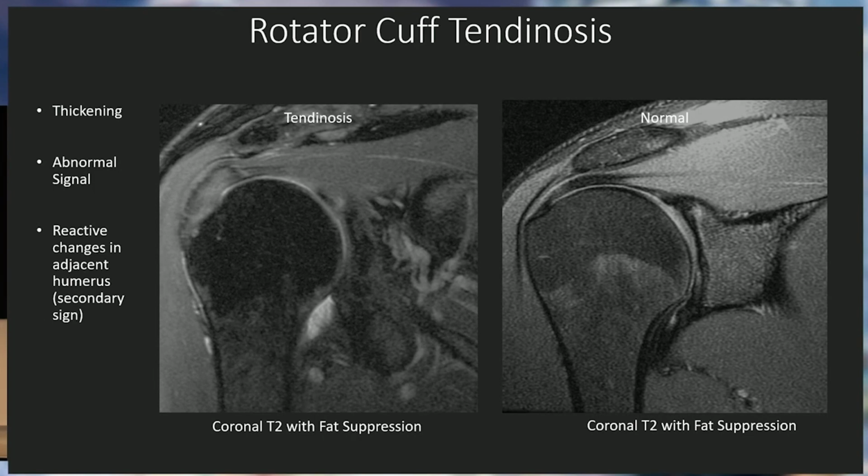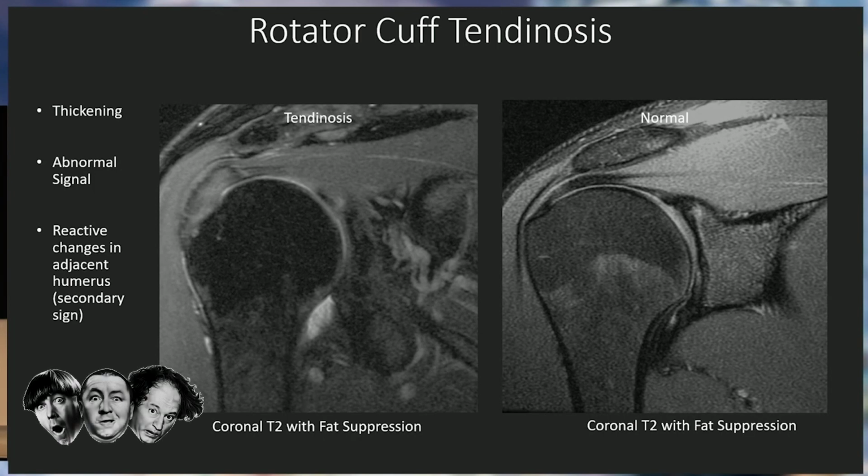Another plane to get comfortable with that can really improve performance is the sagittal plane. Most people are not comfortable with the sagittal plane, usually just because it's not reviewed as frequently. But one way of going through that is that so-called Three Stooges approach.